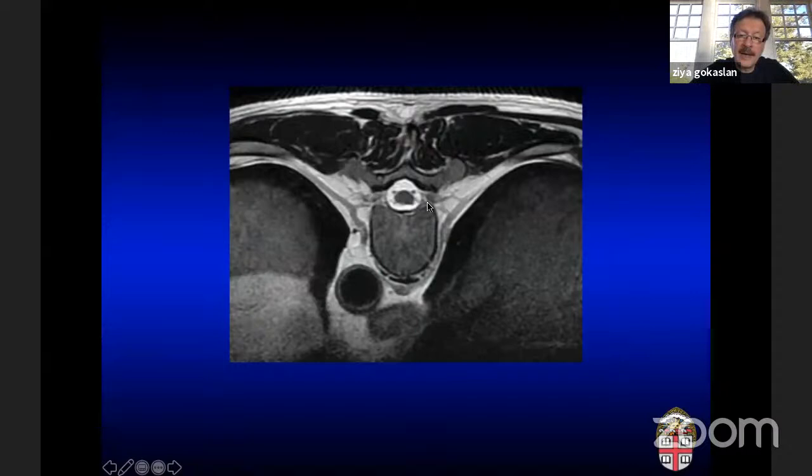And then you stay in this areolar plane from dorsally, and then you can develop this plane very nicely and stay dorsal to the great vessel that keeps you out of trouble, so to speak. And I'll show you that in a video. This shows the channel where we work through between the vertebral body. People think this is a subperiosteal plane. It is not. You cannot really elevate the periosteum here. You have to stay outside the periosteum.